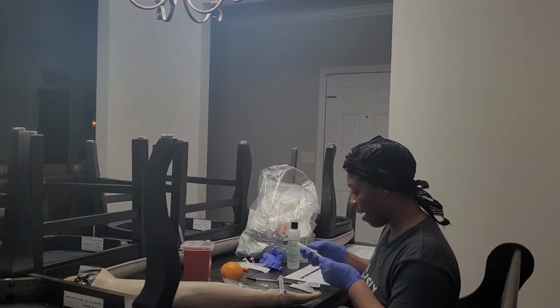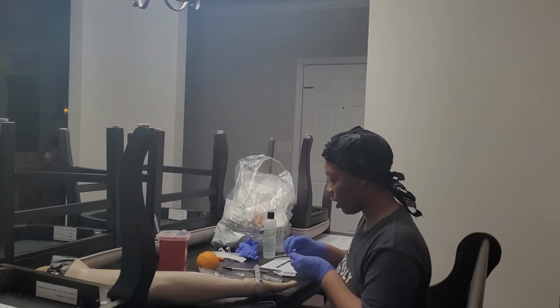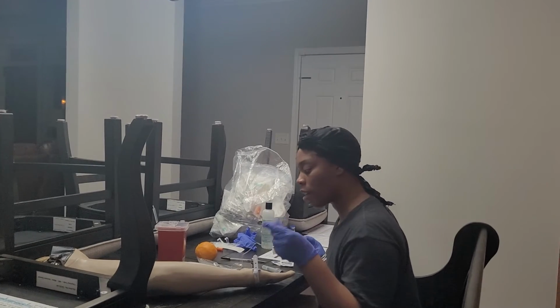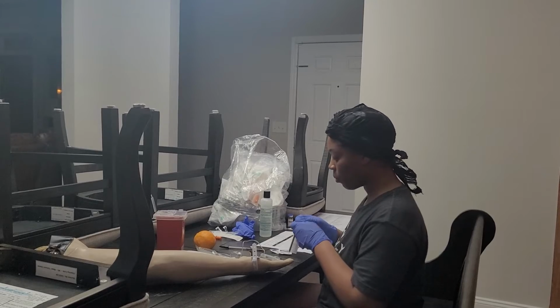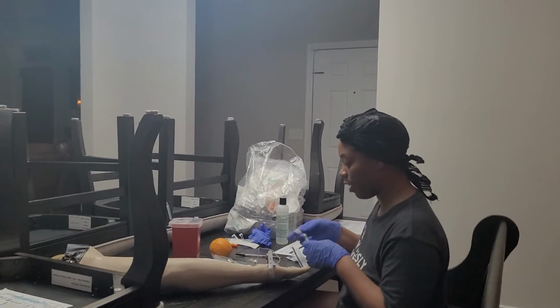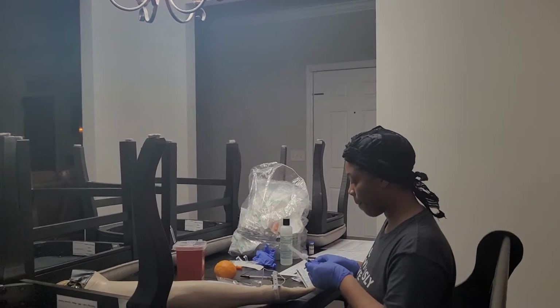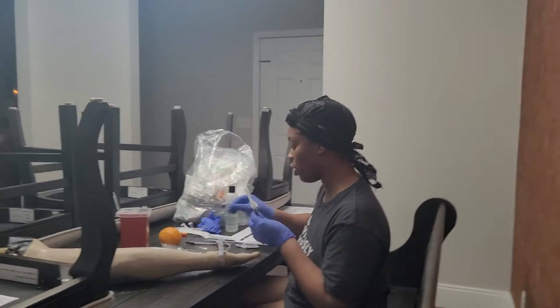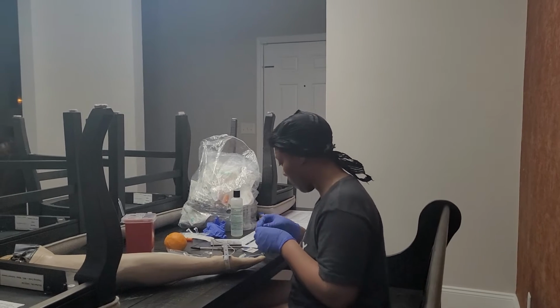Because I only have to administer 2 mLs, I'm going to use this syringe here. Now, my patient, Miss Larson, actually has extension tubing. So we're going to get her connected here, get her set up. I attach my needle. I attached a 22 gauge needle to my 3 mL syringe.